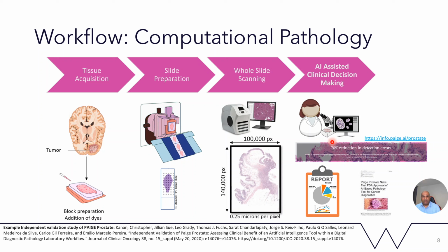So if we have a large data set of patients for which we have these images, and we have, let's say, what was their disease type, whether it was lung adenocarcinoma or lung squamous cell carcinoma, or in case of breast cancer, whether someone's breast cancer was HER2 positive or negative, then we can train a machine learning model by giving it the image as input and asking it to predict what would be the status of the receptor, in this case, in my example, HER2, for that patient.